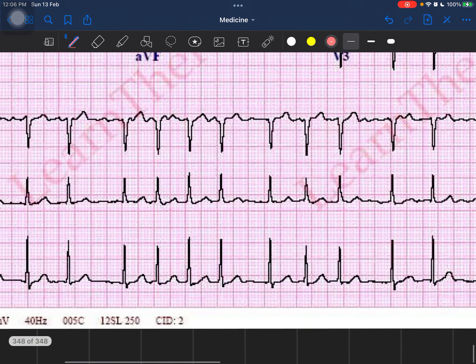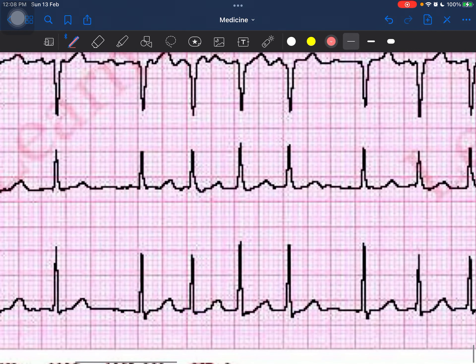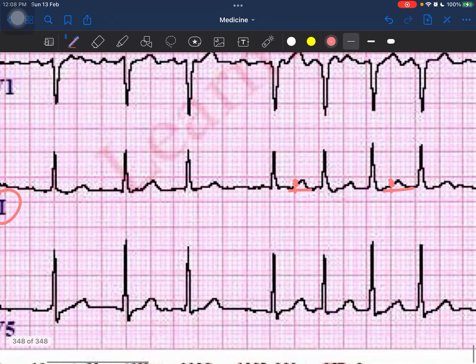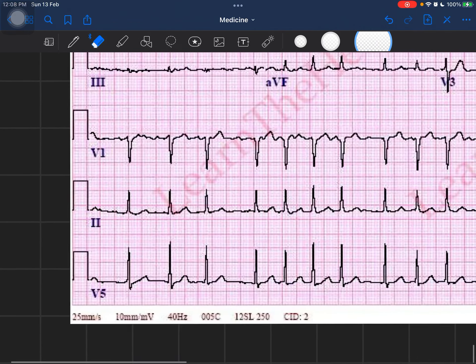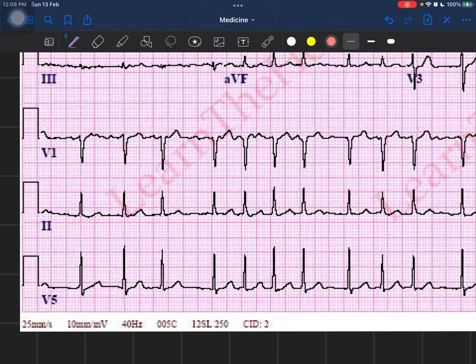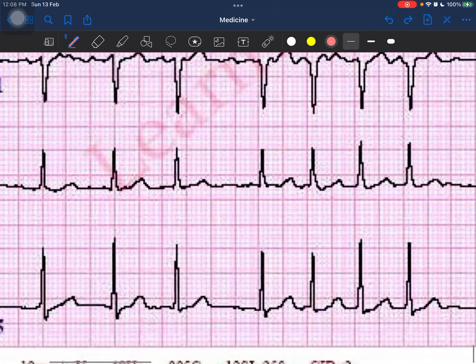So can you see a P wave? If you count the boxes this wave has covered — from baseline it spans about 3 small boxes in lead II. Since lead II is a limb lead, T waves are less than 5 mm, but P waves should be less than 2.5 mm. This wave is clearly more than 2.5 mm, so it is not a P wave — it is actually a T wave. The most important skill here is being able to differentiate a P wave from a T wave.